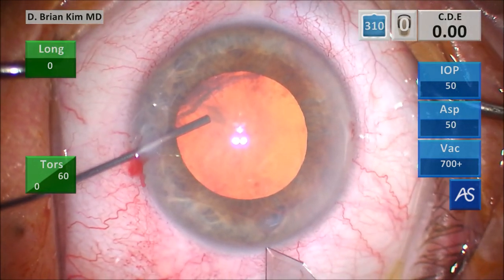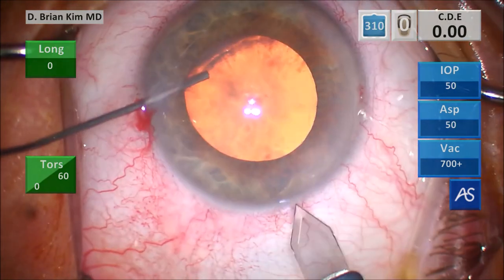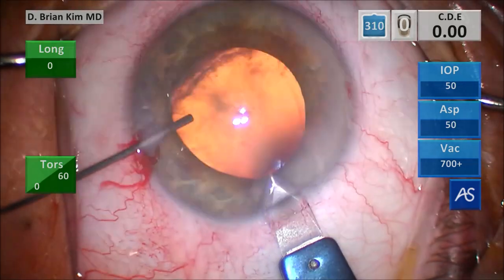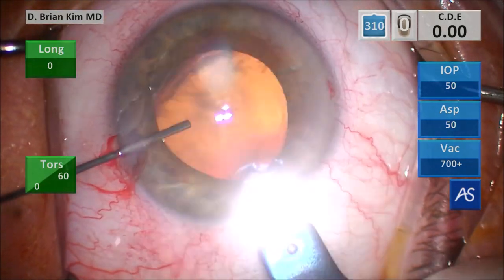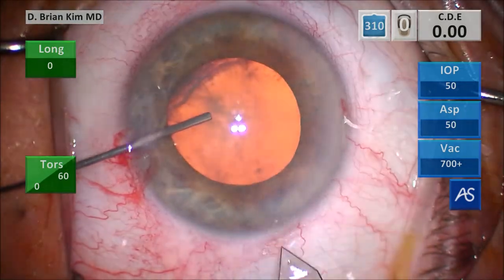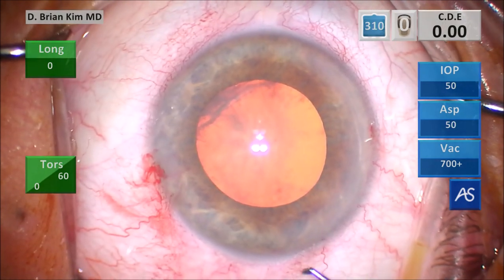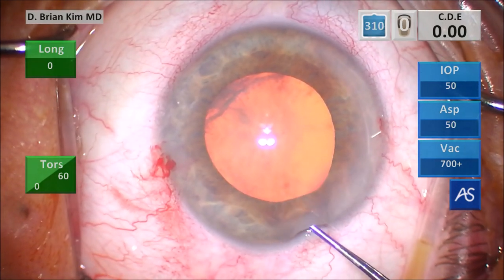Holding the eye with the cannula, this is a triplanar corneal incision. I make a vertical groove, place the blade into the deep part of the groove, tunnel through the cornea, and controlling the eye with the cannula, I'm able to control the length of the incision and then I enter. I push some more viscoelastic at the end. And this is the puncture style rhexis.